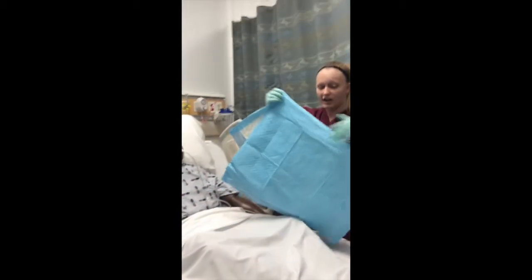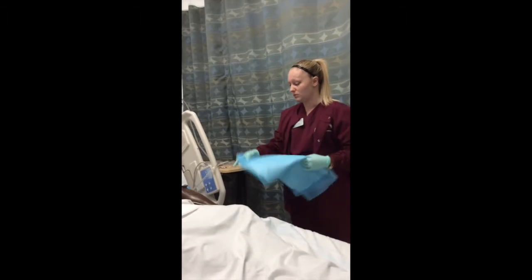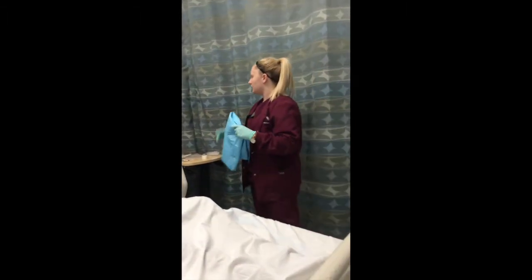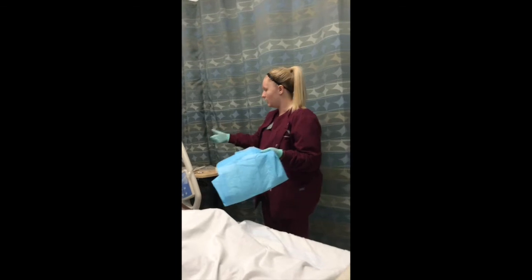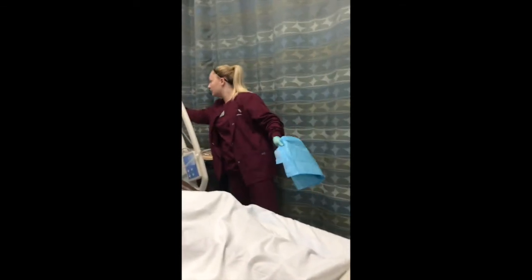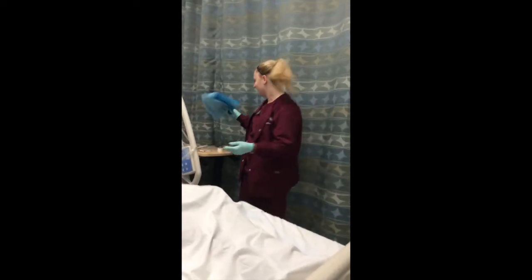I'm going to go ahead and document my insertion. I'm going to document the naris, the size of the tube, the time, all that stuff. And then I'm going to start my I and O measurement. Of course, the secretions that come out of here, I'm going to put a mark on this basin right here. I'm going to mark each shift with the time, my name, and the date.